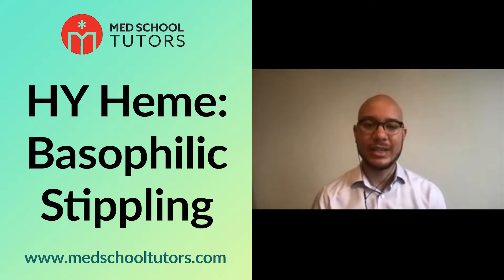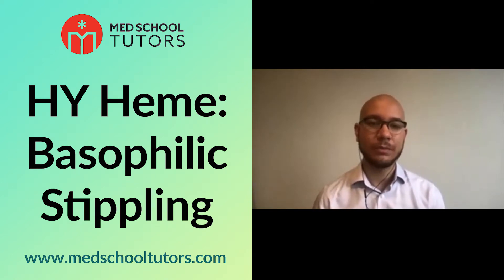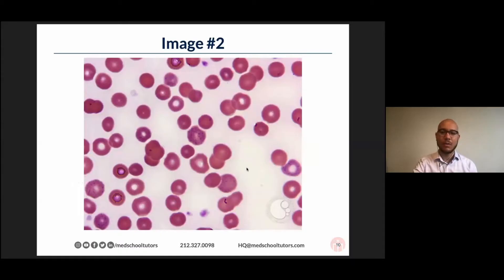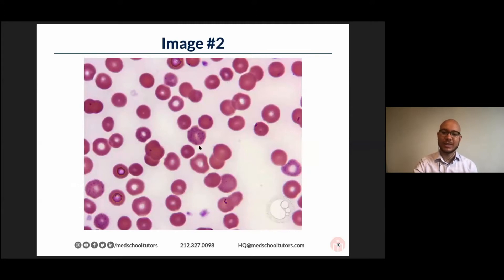Here is the next image. Take a moment to take a look at it. You'll notice that what we really have on the screen here are basically exclusively what look like red blood cells, and we also see a couple of platelets in this particular smear.